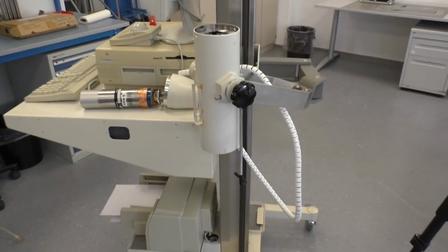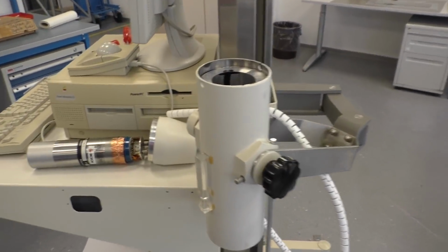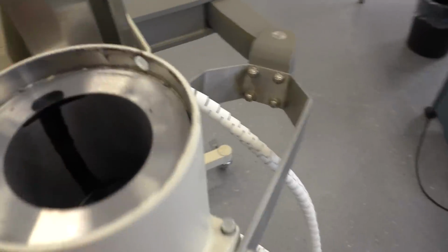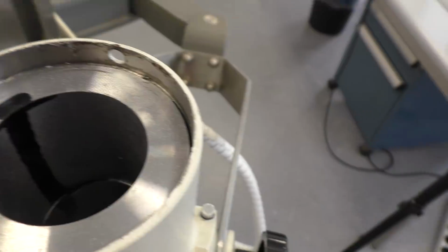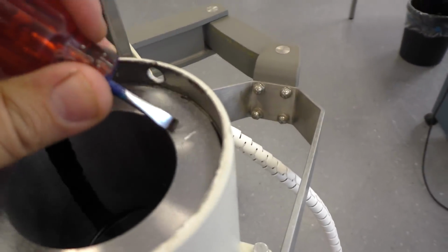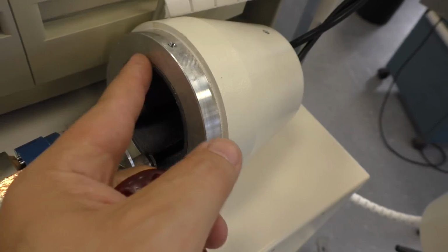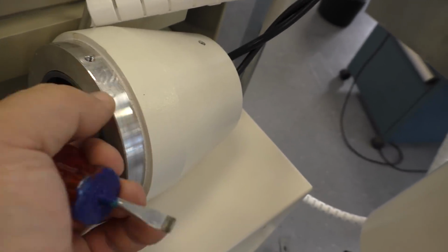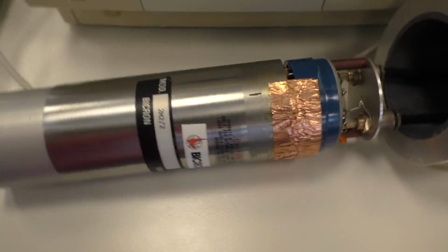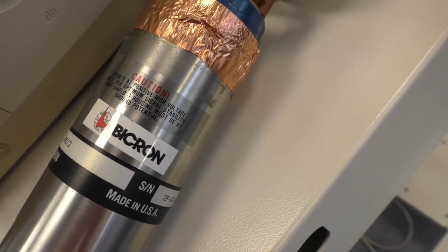I always wondered why this cart here is so heavy. It weighs about 300 pounds or 140 kilos. And there's only a Macintosh, a printer, a little bit of electronic box, but the entire tube here has a thick layer of lead. Yes, it's lead. You can see it here. It is soft. You can scratch it easily. Also here on the cover, on the back cover, there's a lead insert. And now the rest is, I think, aluminium. And that's the tube, which we operate at positive high voltage only.